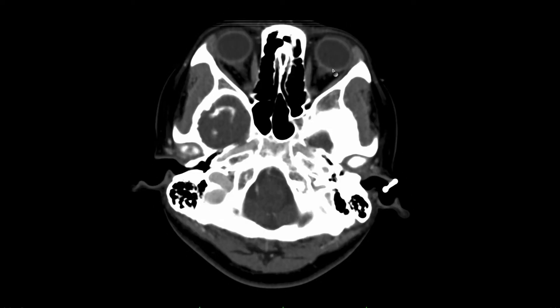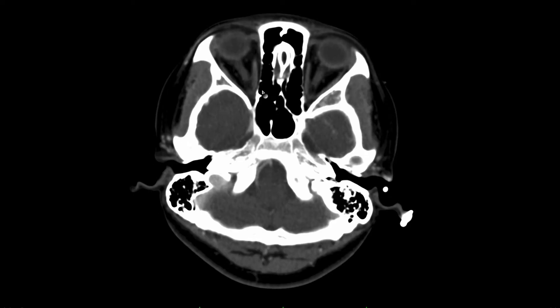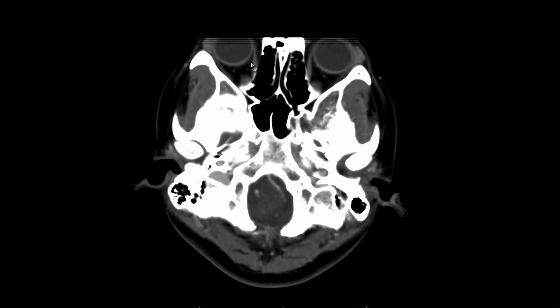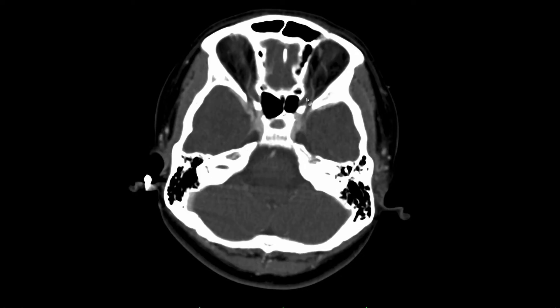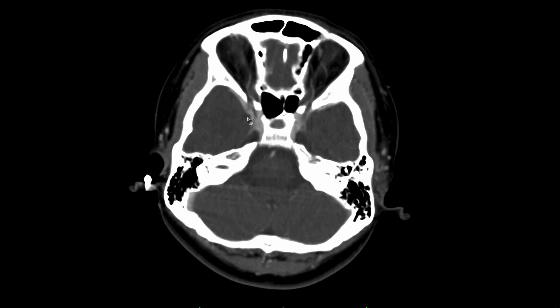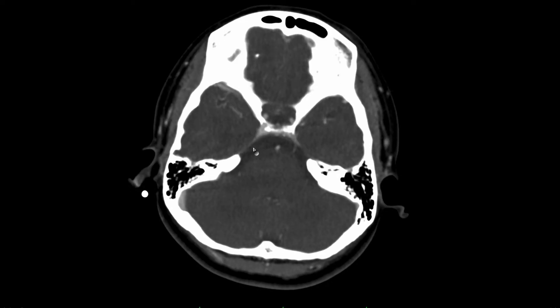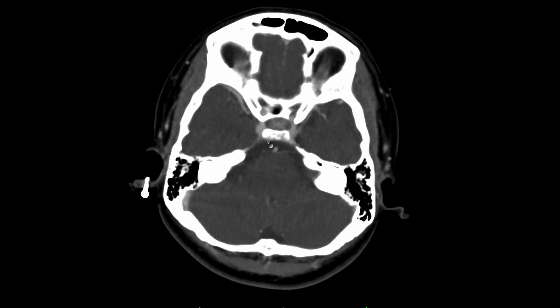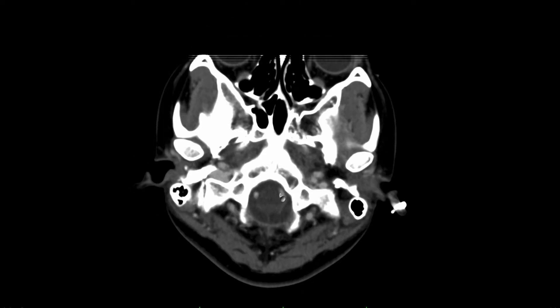We look for secondary features arising from dural venous sinus thrombosis, which would be intracranial hypertension. Patients with intracranial hypertension can get papilledema with distention of the optic nerve sheath complexes, which we don't see here. There is no flattening of the sclera. They can also get enlarged subarachnoid outpouchings, so we look at Meckel's cave, and we don't see significant outpouching. There is also no tonsillar descent.